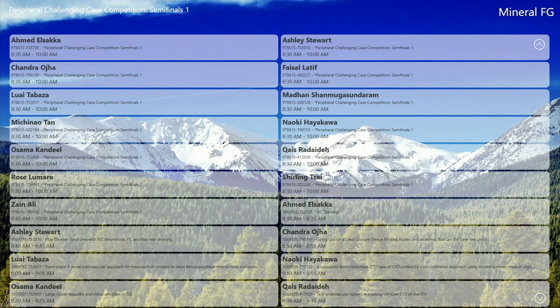Do you see any significant change in radiation dose with your change? Thank you very much. Very nice suggestion. Radiation dose is slightly higher in digital angiography, but the newest angiography machines by Philips or Canon can reduce radiation dose. So I think it is no problem. But the significant reduction in the contrast dose, I think, was from 117 to 30 cc's for a limb.